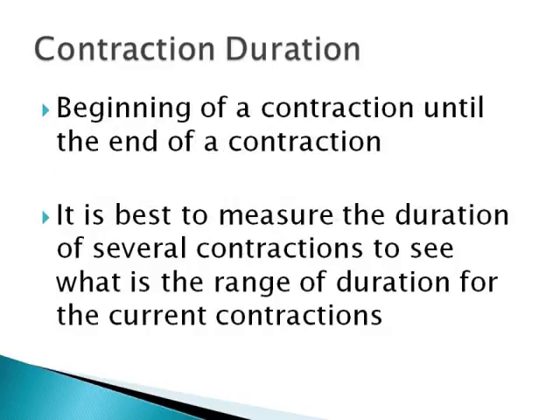Contraction duration. This one is just the beginning of a contraction until the end of that contraction. There's no resting period measured with this one. As with the frequency, it's best to measure the duration of several contractions to see what's the range of all the durations.